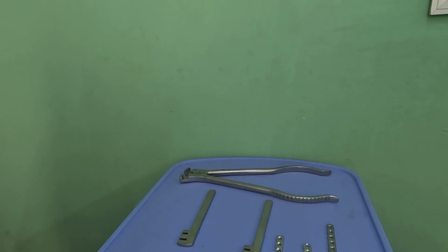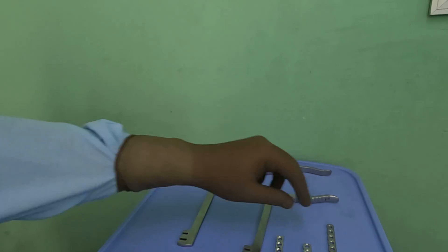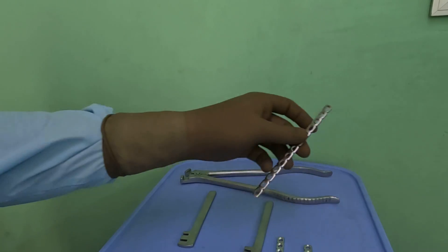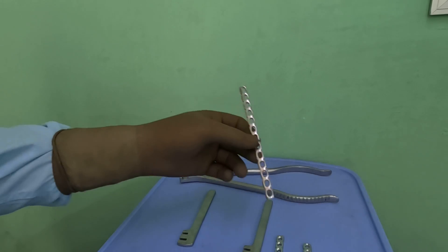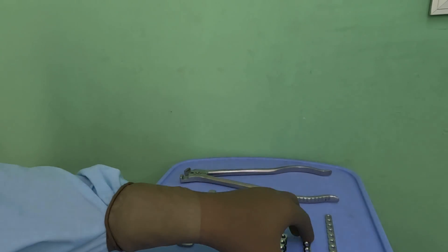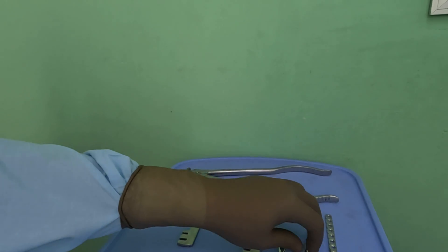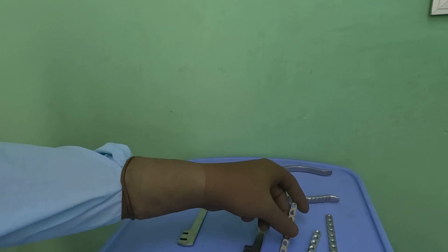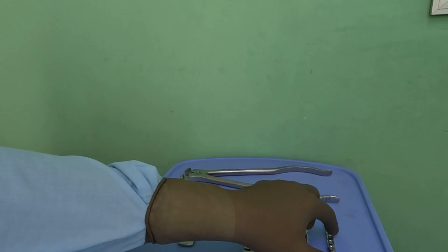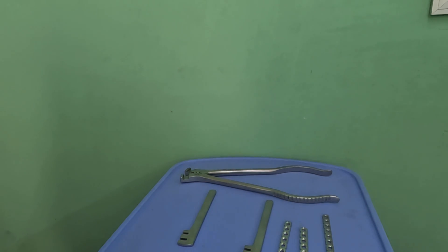Today I will be demonstrating the bending of reconstruction plates which are normally required in acetabular fixation. You either need a long plate, typically 13 to 15 hole, which is needed for the anterior brim, or a shorter plate, either 8 hole or 9 hole, for the posterior part. These are the three most common plates used in acetabular fixation.